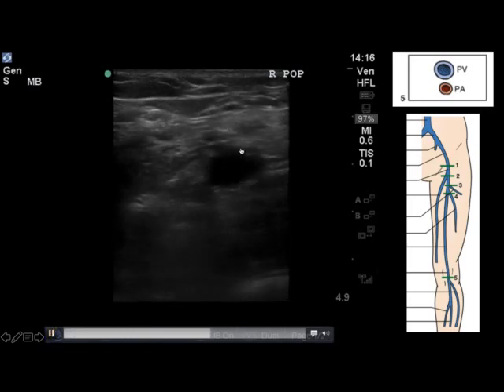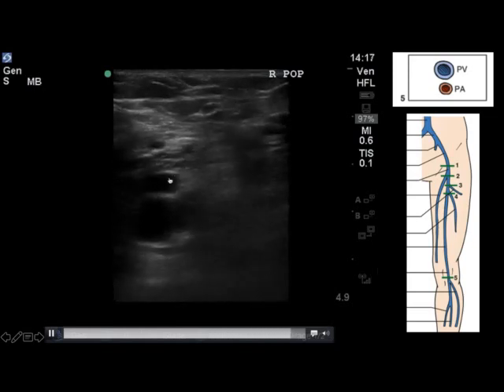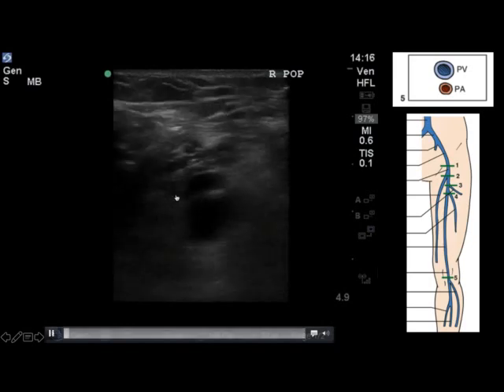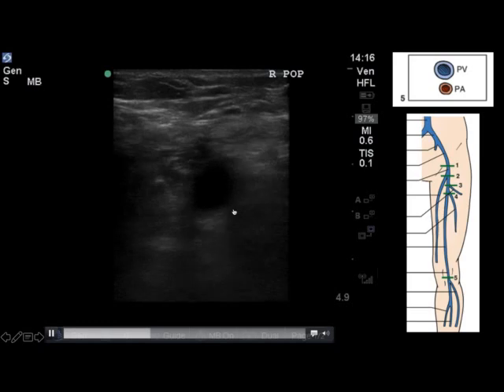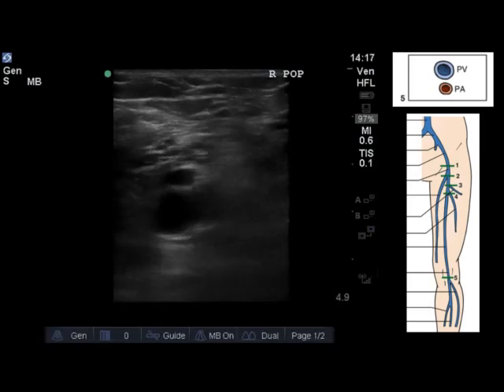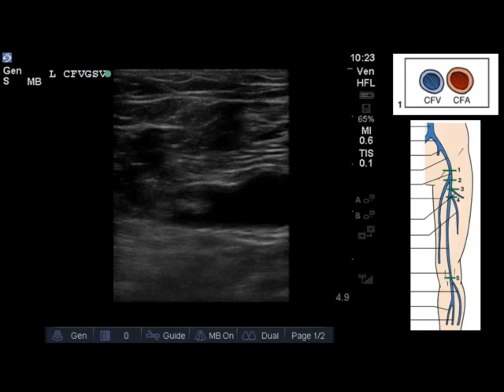Reminding yourself 'pop on top,' you have the popliteal vein lying superficial to the popliteal artery. Not exerting too much pressure so you don't compress the vein and hide it from yourself, and pressing things down so that you know at this fifth and most distal point there is no clot present.